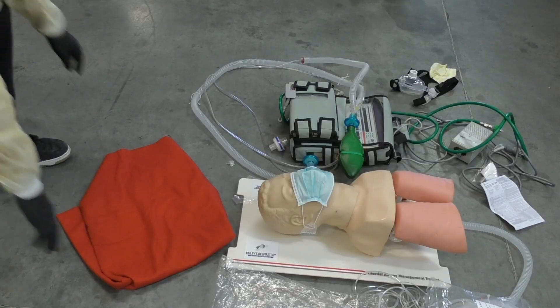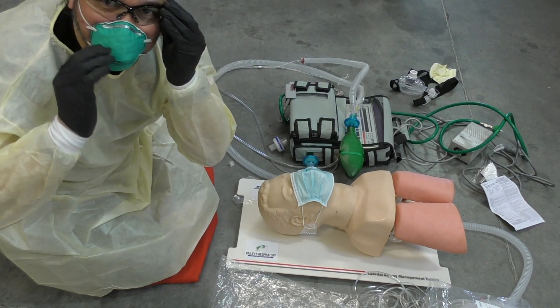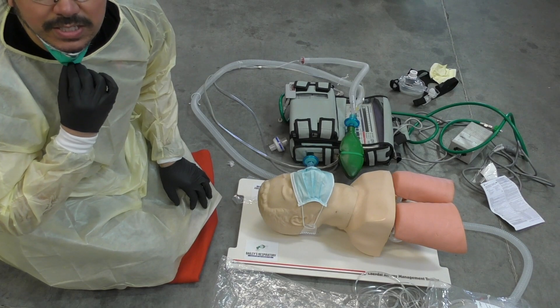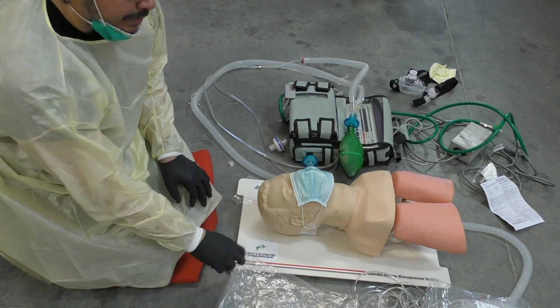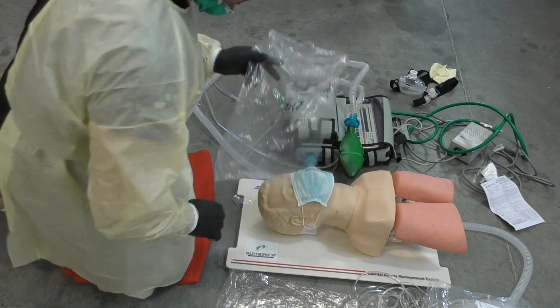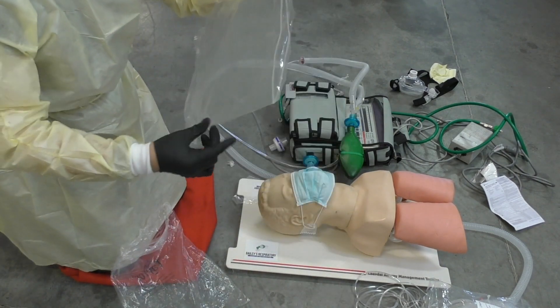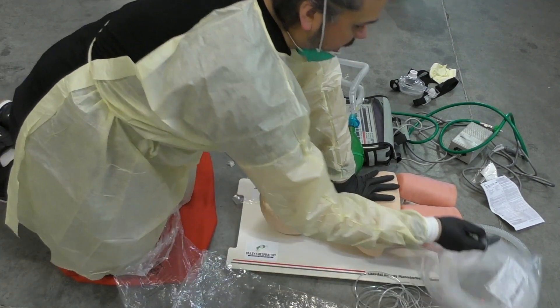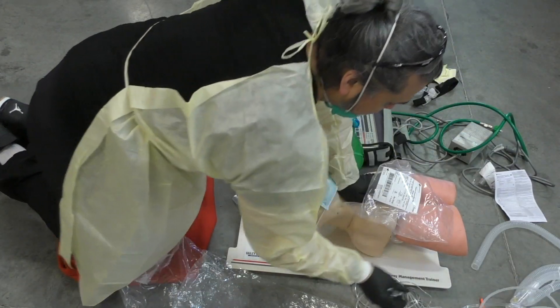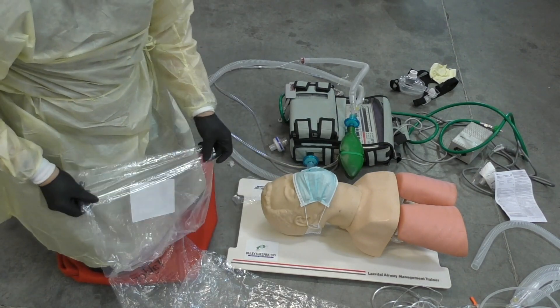We've got our PPE on and we're ready to go: N95 mask, eye protection, gloves, and gown. Make sure anyone helping you is gowned up the same. I'm going to take the mask off just for the video so you can hear me. We have a lot of clear plastic bags here because we're going to use them all — the blanket bag, the Ambu bag bag, and the vent circuit bag. These clear plastic bags are going to protect us from the patient and cross-contamination.